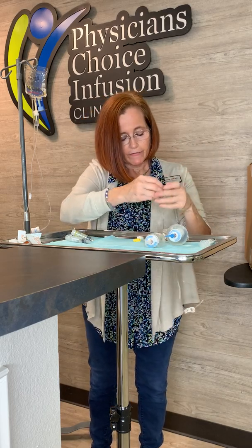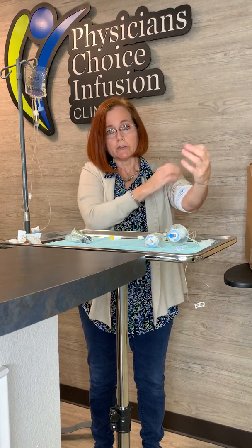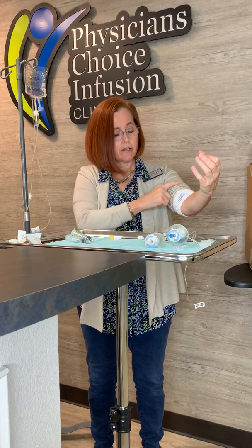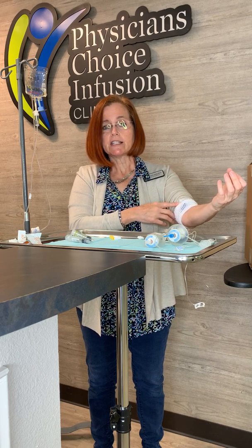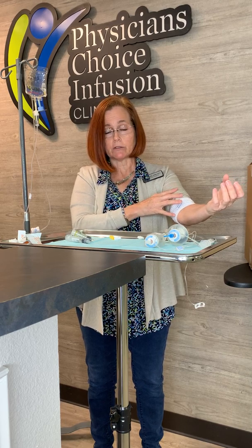While you have your PICC line in, do not go swimming and do not take a bath. You can get some press-and-seal cling wrap, wrap it around and tape it, and you can take a shower — but protect the site. There is a dressing over your PICC line. If it gets soiled, or any fluid gets underneath it, or it's coming off, let your home health agency know — they need to change it because it is a sterile dressing and we want to keep it sterile.